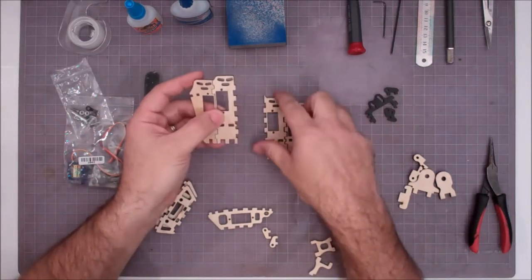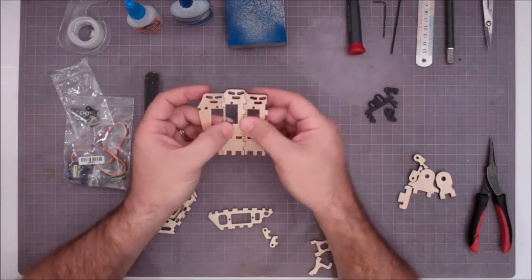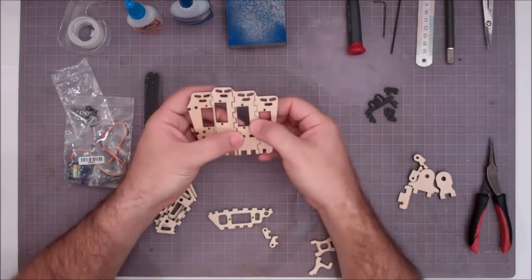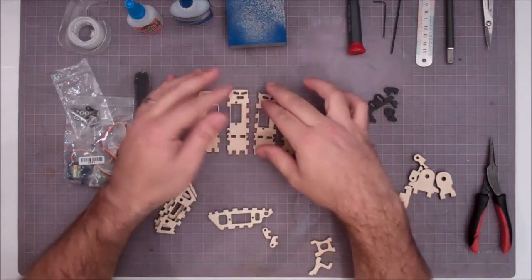See, that slides together nicely. That one slides together nicely, and you can pivot them because they're mounted on a bit of an angle. And then this fourth one here slides together nicely. So make sure those all fit together nicely before we start this process.